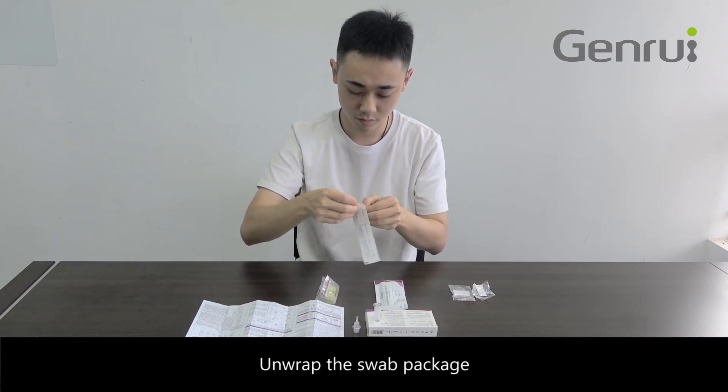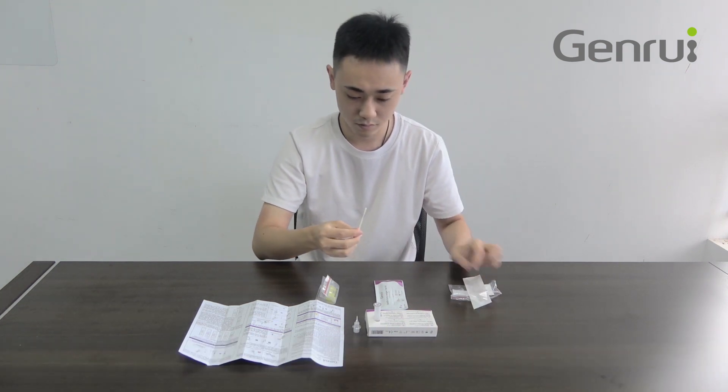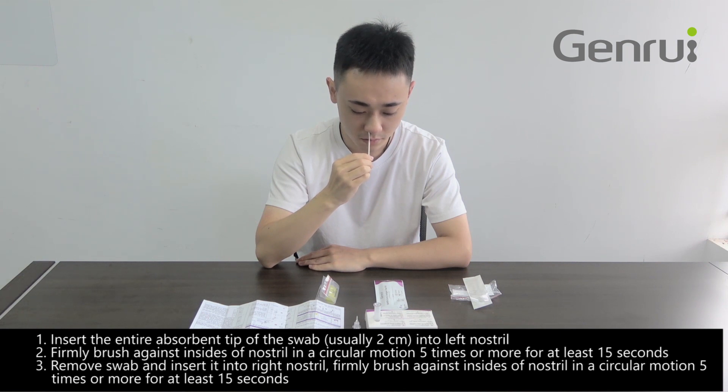Unwrap the swab package. Insert the entire absorbent tip of the swab into the left nostril. Firmly brush against the insides of the nostril in a circular motion 5 times or more for at least 15 seconds. Remove the swab and insert it into the right nostril.